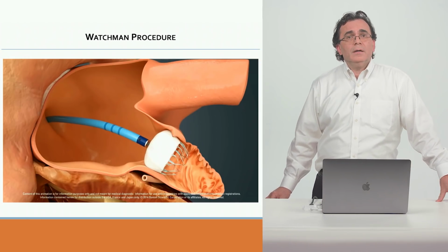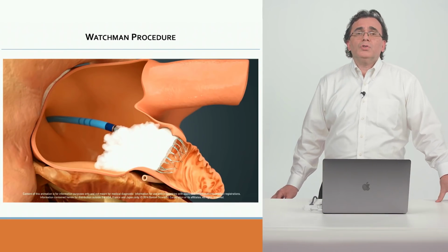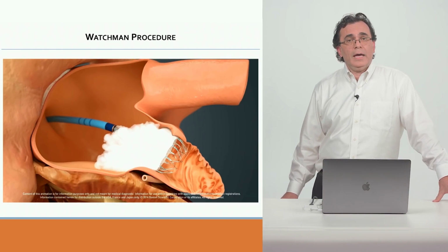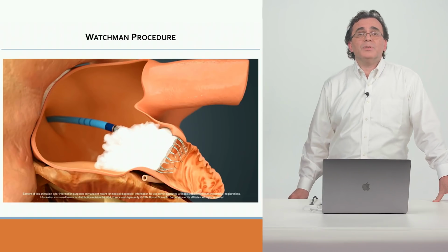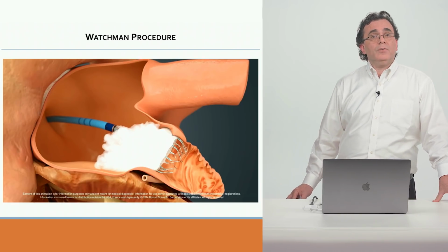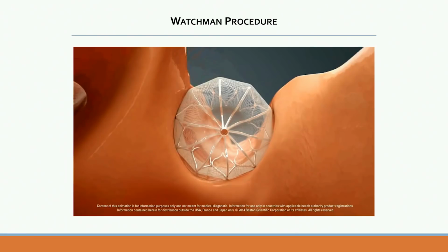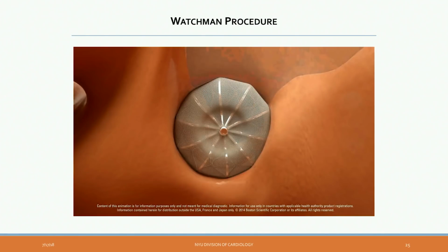After we are satisfied with the position of the device inside the left atrial appendage, we prepare to release the device. An additional angiogram is done to check for leak, simultaneous to color Doppler assessment on echocardiography. If we are satisfied with the position, the device is then released. Initially it's permeable to blood flow through the device, and the flow through the device is normal. However, flow around the device is abnormal. Over time, the device will endothelialize and will become part of the normal structure of the heart.